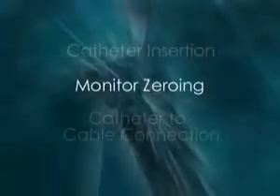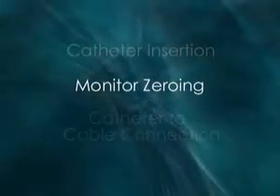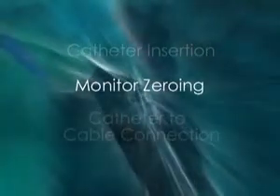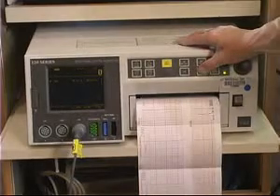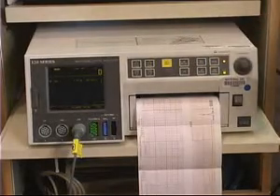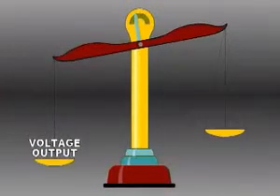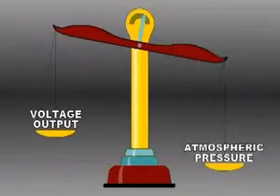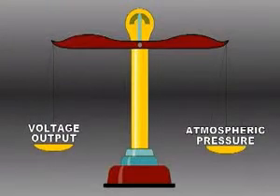Step 2 is monitor zeroing. Zeroing is the process of establishing a zero reference relative to atmospheric pressure, from which intrauterine pressure monitoring is referenced. Zeroing is accomplished by pressing the zero switch on the fetal monitor while it is receiving an electrical signal from the transducer. The transducer is like a scale, with a voltage output offset that requires balancing when atmospheric pressure resides on the transducer. Pressing the monitor's zero button balances out this offset to establish a zero reference, so changes in intrauterine pressure can be accurately observed.